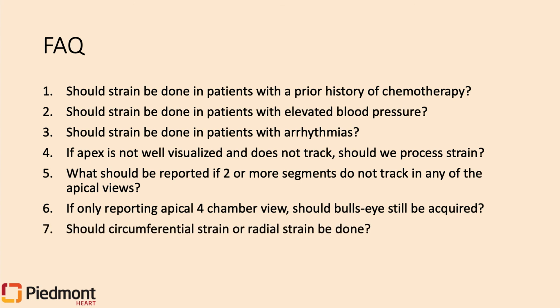Should circumferential strain or radial strain be done? At this time, there is limited clinical utility to circumferential and radial strain just because the data is not there yet. I think in the future it will only be a matter of time before we incorporate all the fibers of the heart to make a more thorough assessment of a patient's systolic function. But because longitudinal strain is what we are using clinically, our expectation is just that you try your best to obtain longitudinal strain in all your patients.